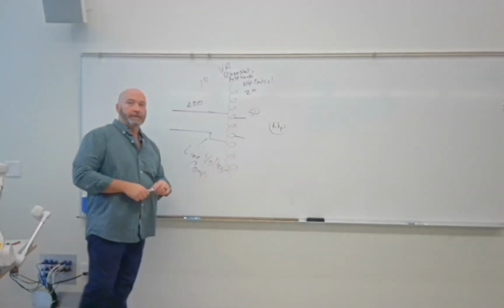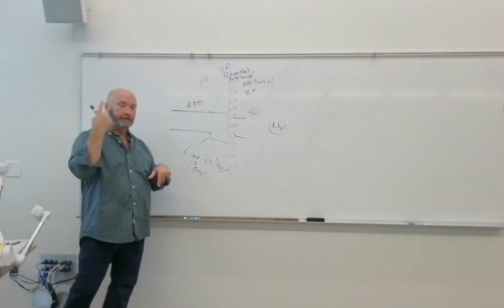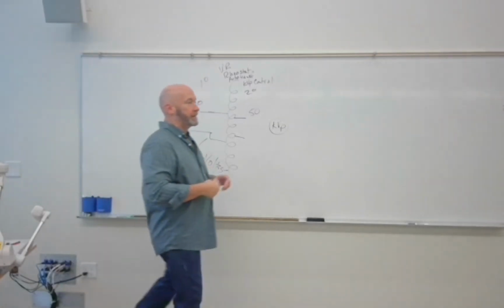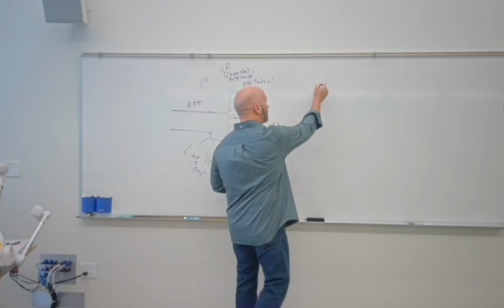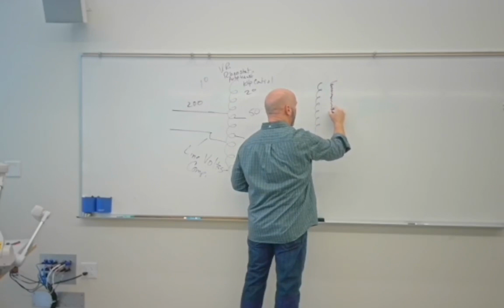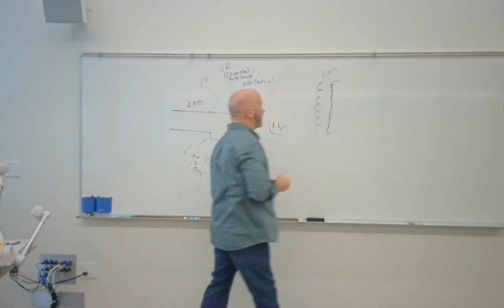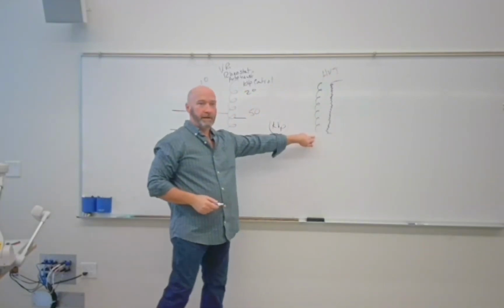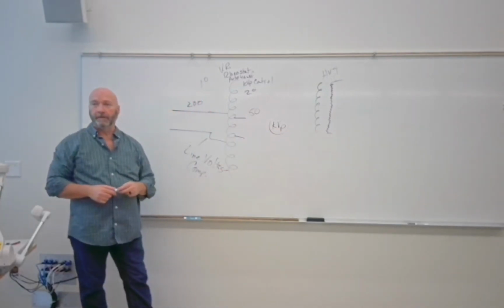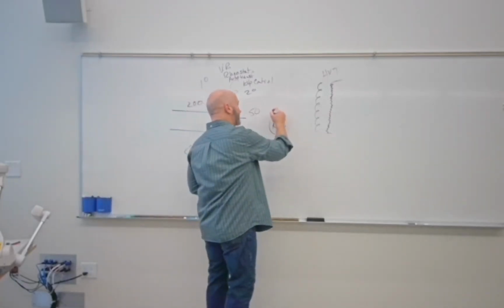And what do we do with the autotransformer? We increase or decrease voltage, right? So where is kilovoltage created? Already mentioned that. It's right in the name: high voltage transformer, right? So this is where the kVp is created. So if this is our kVp meter, is it truly reading kVp? The answer is no.